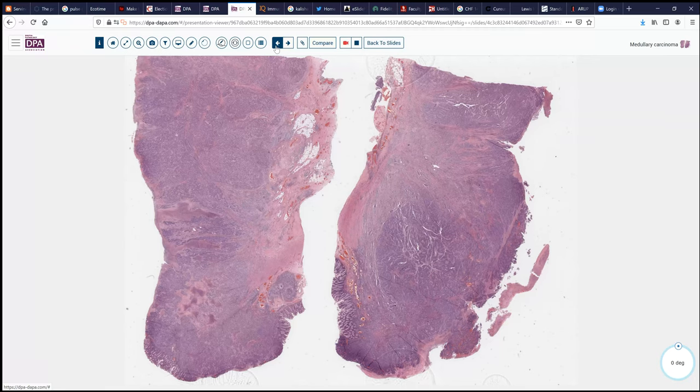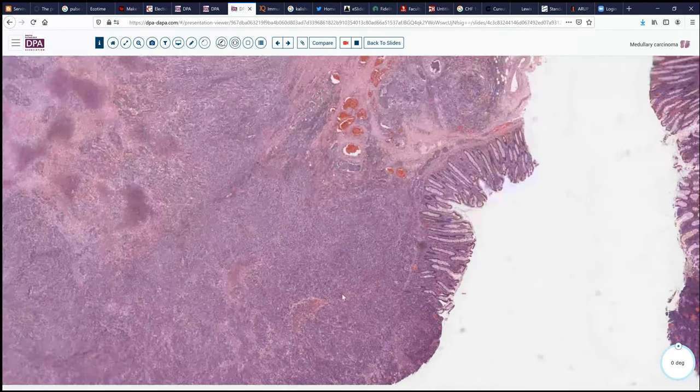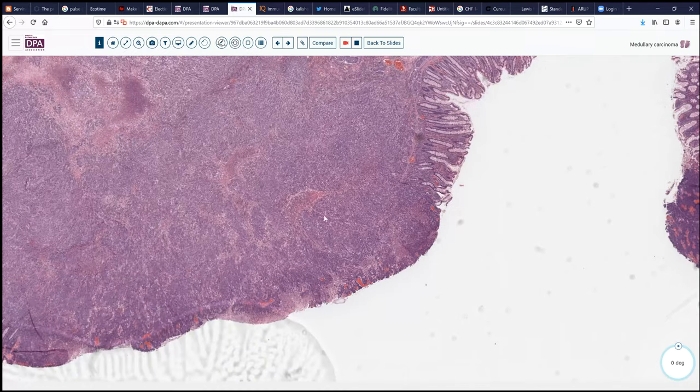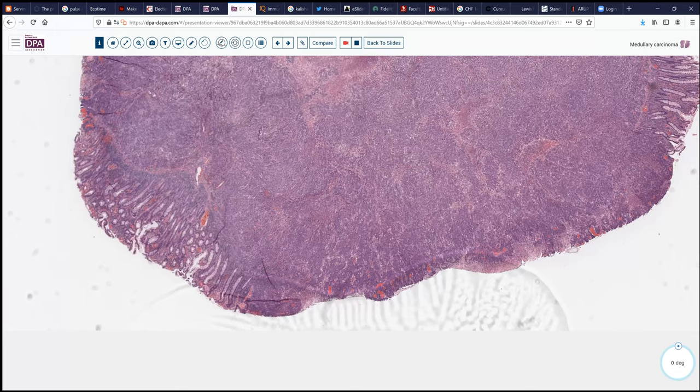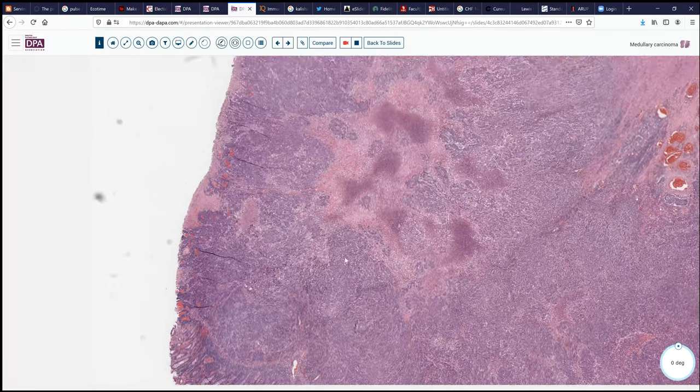So this lesion, like many lesions in the right colon, is a little bit on the bulky side. We can see that it's quite blue, and it's got some areas of maybe necrosis here as well, and it's infiltrating well into the wall. So we'll go look at the interface first off with the colonic mucosa, and we don't see conventional dysplastic changes, at least adjacent to this tumor. Areas of ulceration certainly account for her blood loss and anemia.